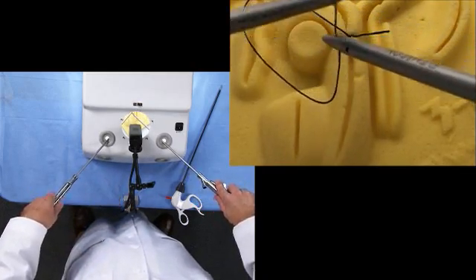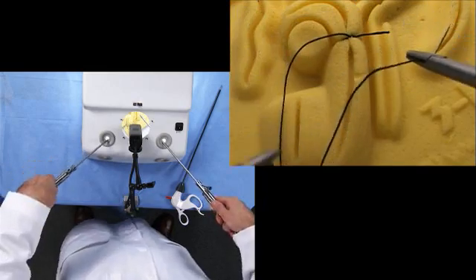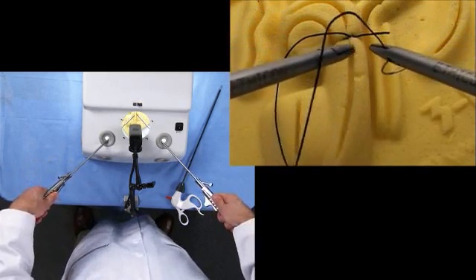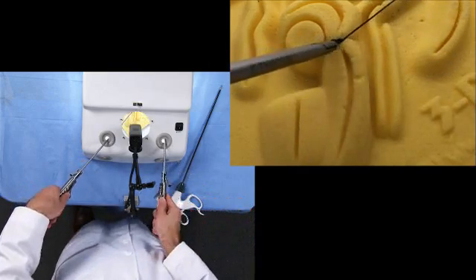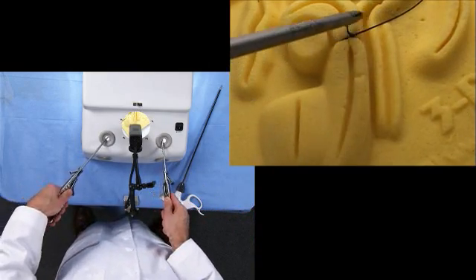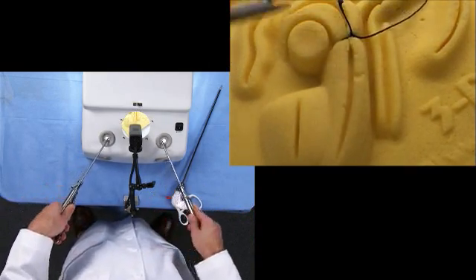We're going to rotate hands again, needle's to the right of the needle driver, suture's coming back at us, rotate externally to create a camel's hump, and grasp the suture. And we're going to put the tag out of the way.